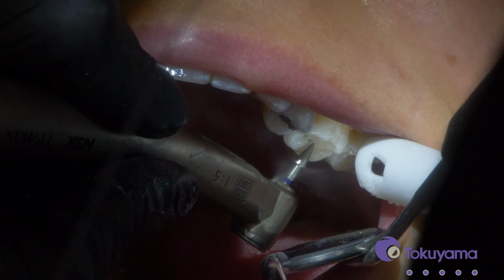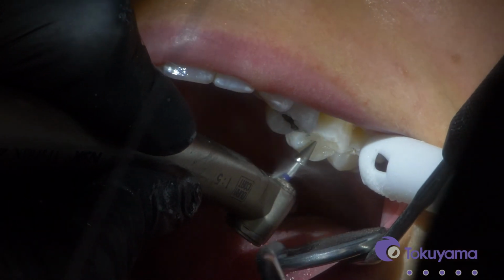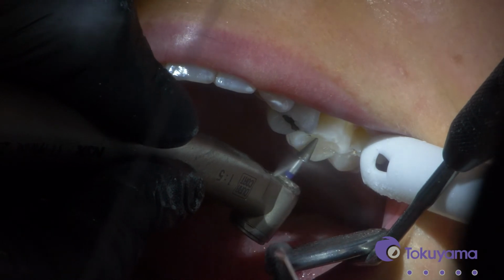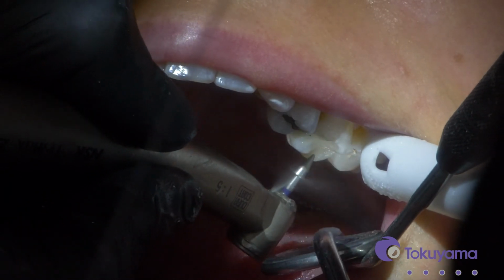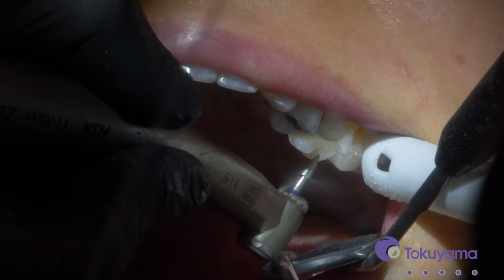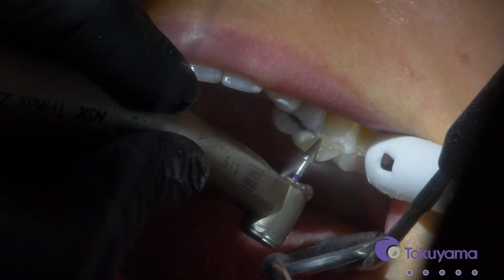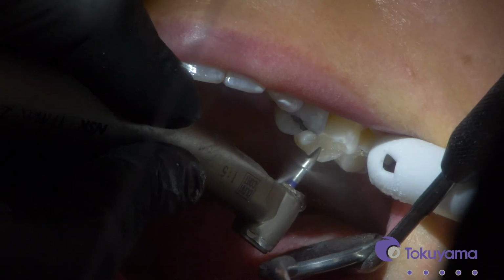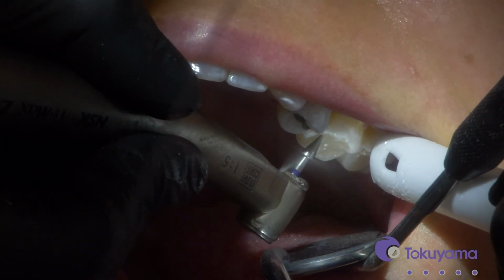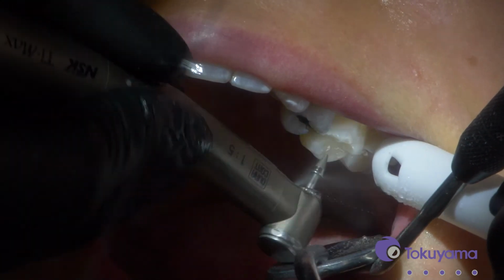Just a few areas to adjust here. And I don't like always using a football shaper to adjust my occlusion. And the reason for that is teeth aren't always shaped like a football. So here I'm going to refine my grooves and adjust occlusion all at the same time.